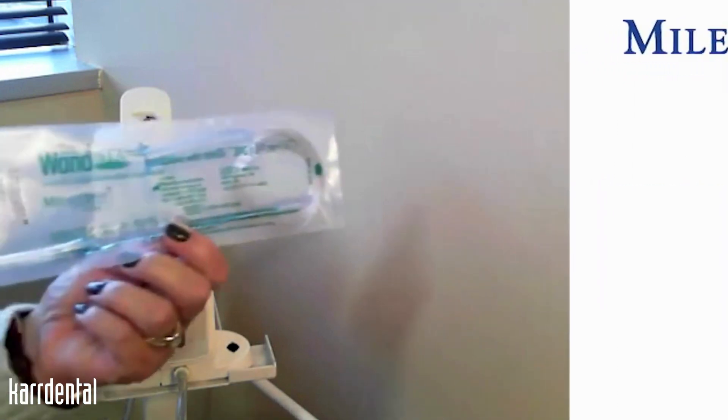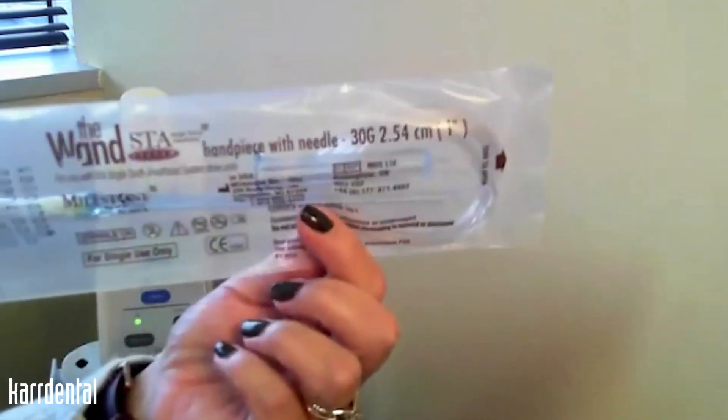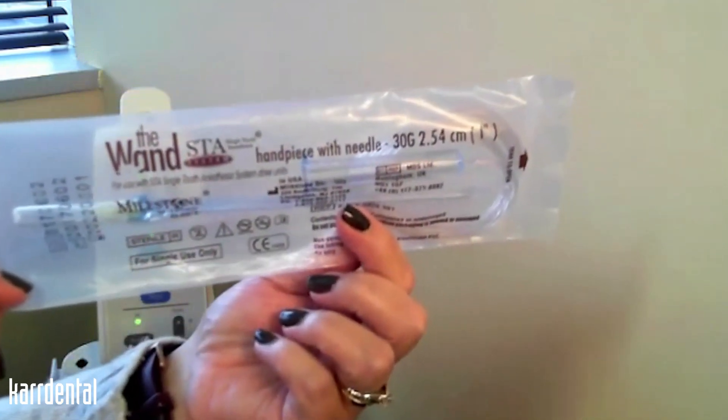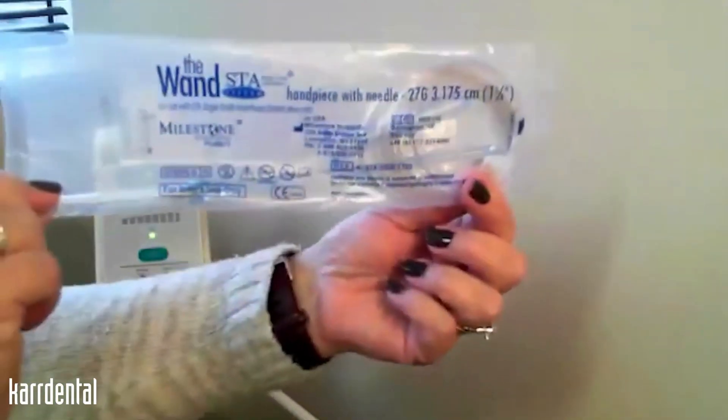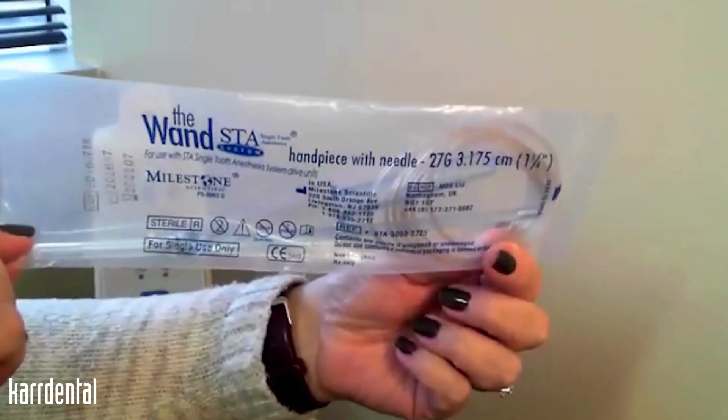We have a 30 gauge half inch, which is our shortest needle that you will use with your single tooth injection and anything on the palate. We have a 30 gauge one inch handpiece for infiltration injection, and our longest needle length is the 27 gauge one and a quarter used for our IA block injection.